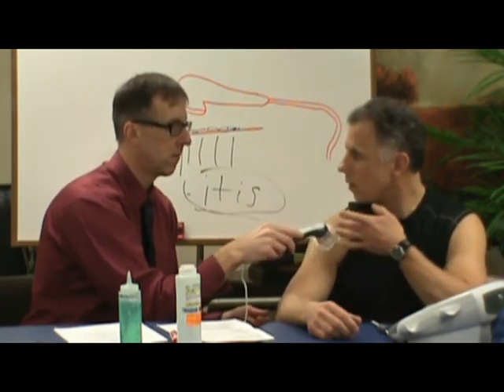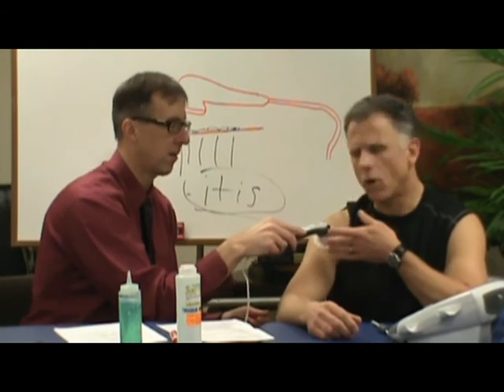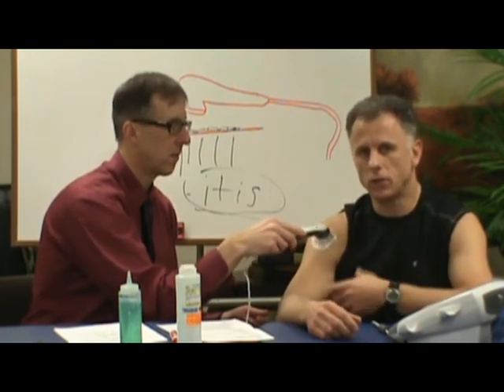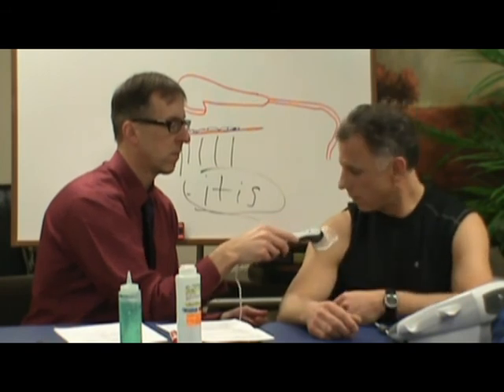Right. Sometimes when I go right over the sore spot, they might say, oh, I feel it right in that spot. So I either adjust the intensity, or I change where I'm doing it, or the speed of the motion of the machine.